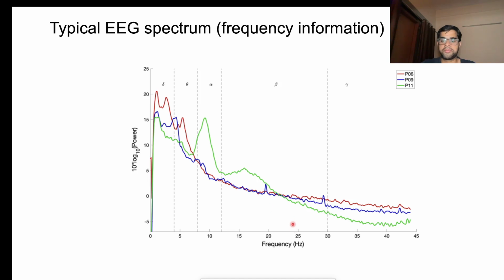Do those blips have any significance in this one, the blue? Yeah, they do. To reduce this pink noise, the decaying noise, we do some kind of normalization. We take a broad average of this whole spectrum and divide by that, or if you're doing log scale you subtract it, so that you eliminate this kind of noise.